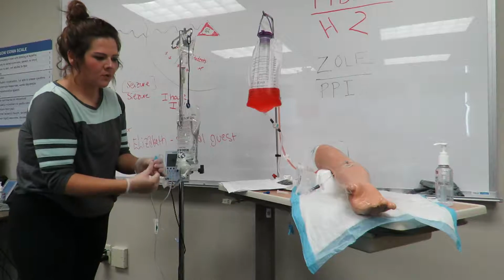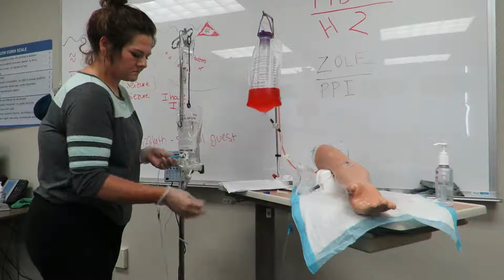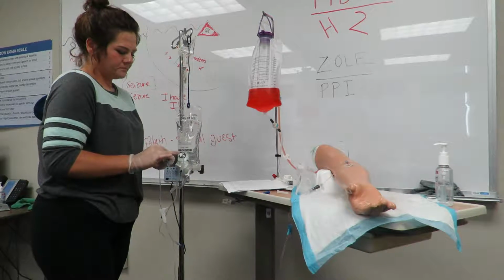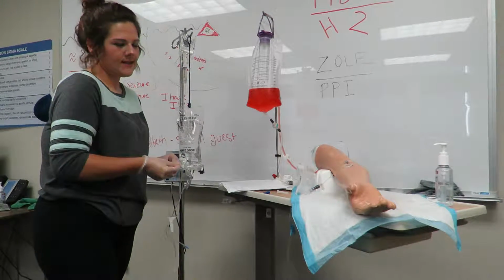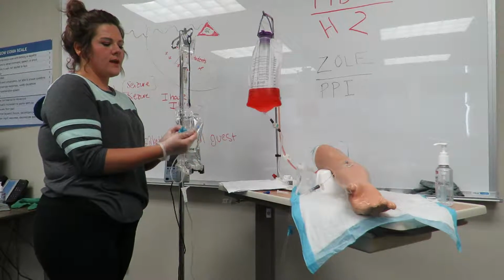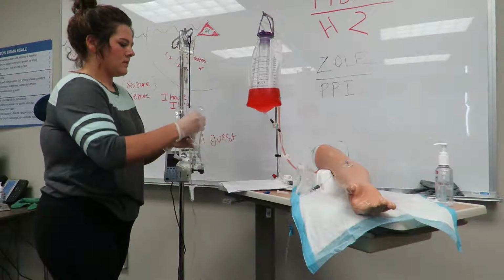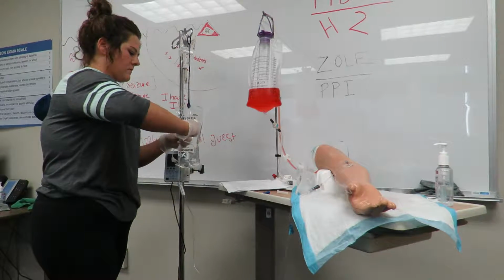And my first port, I'm going to go ahead and clean this with an alcohol swab. Rubbing continuously for 30 seconds. Okay. 1, 2, 3, 30 seconds. All right. And now I'm going to remove this cap. I don't want to touch the end of this to anything because it's clean. I'm going to remove this cap and place it there.